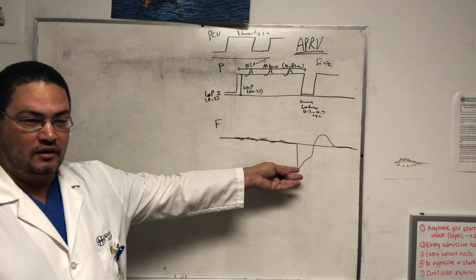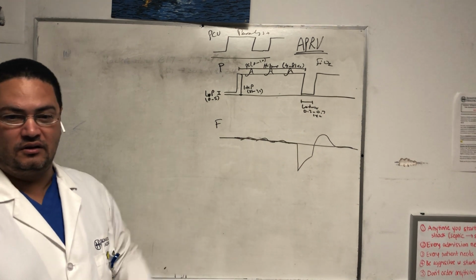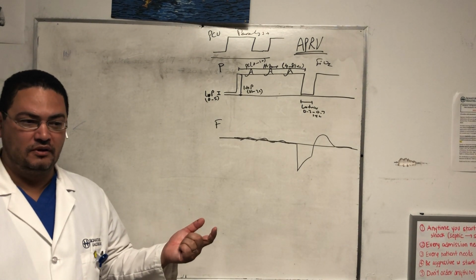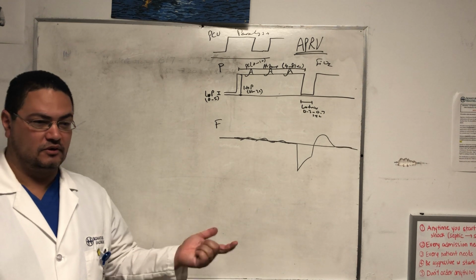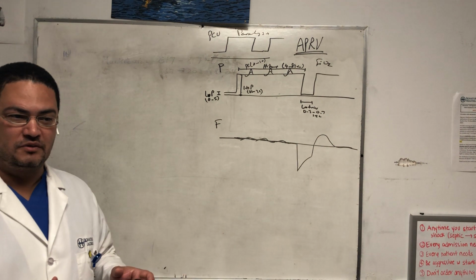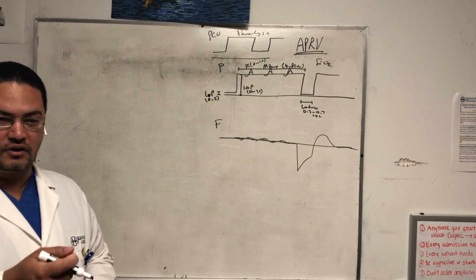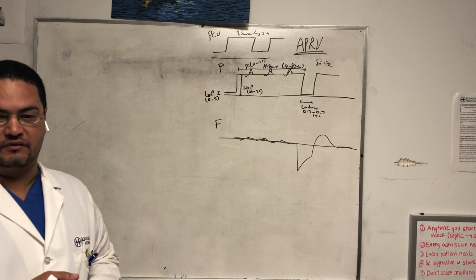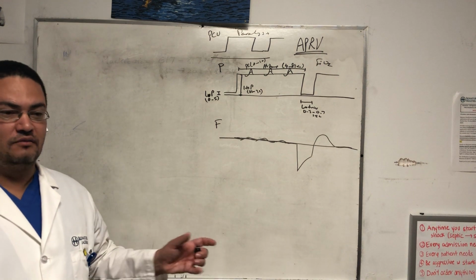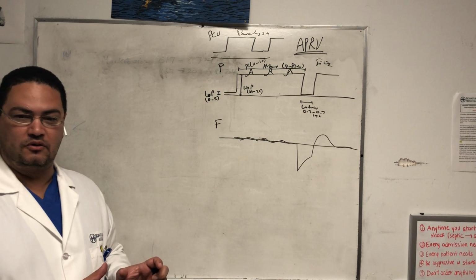The second claim to fame is that it debunked the classic teaching about auto peep. We were taught, everybody knows, that auto peep is dangerous. And we agree, I still agree that the auto peep is dangerous. But here, it tells you that it's dangerous if you don't regulate it. If you regulate it, you can use it to your advantage. That's the point. So it's not dangerous all the time. This mode is using auto peep to improve the patient's recruitment.